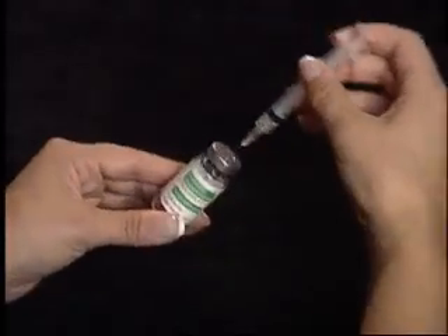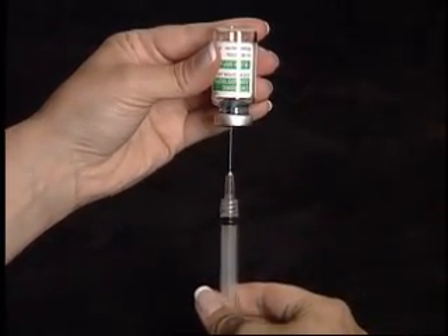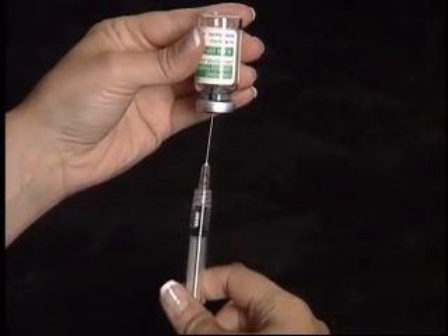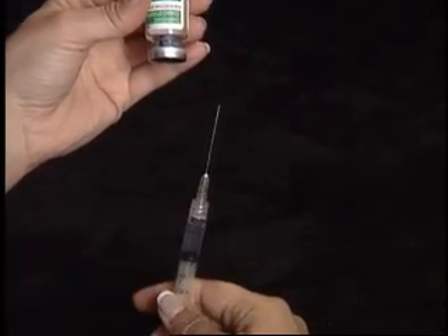Once again, as one complete unit, turn the vial upside down so that the tip of the needle stays below the liquid level. Pull back on the plunger to withdraw the entire contents.